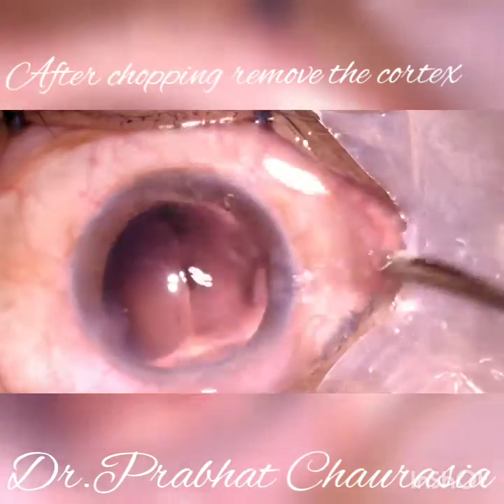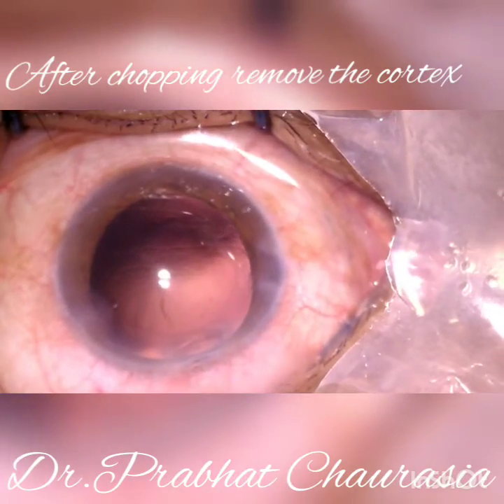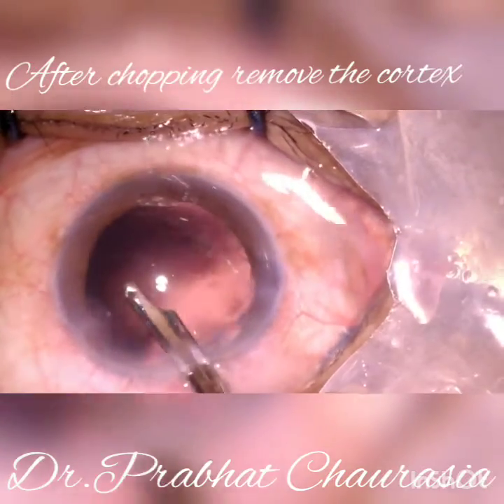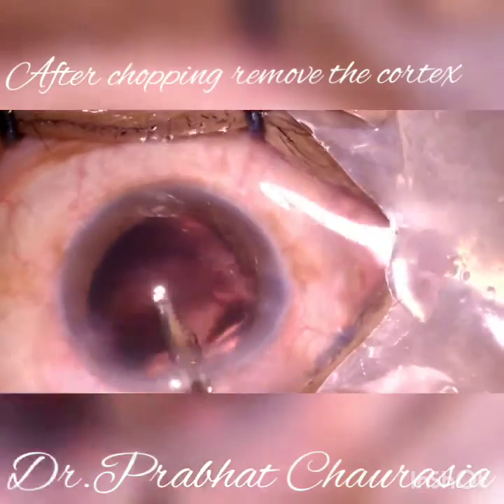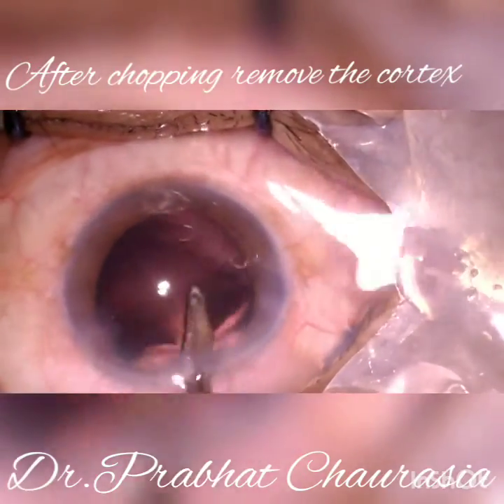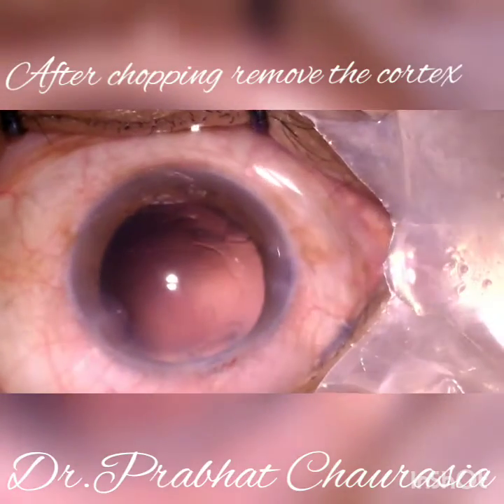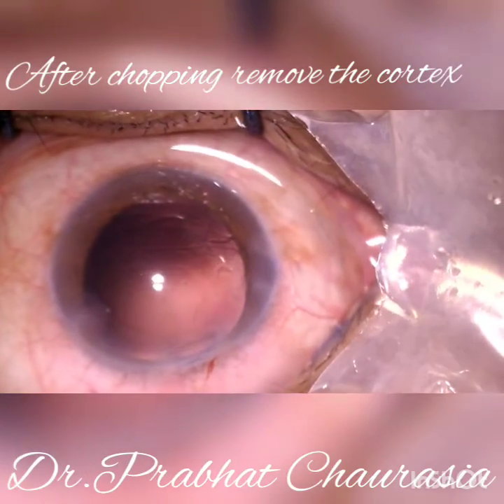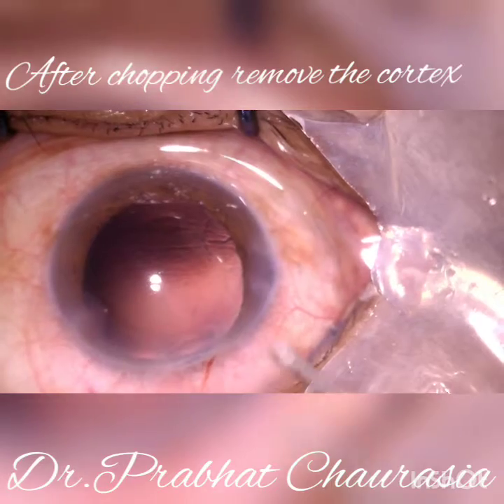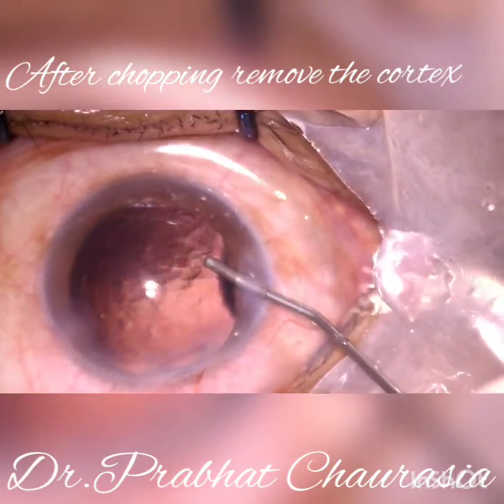This is hydropolishing. A jet of fluid is sufficient to remove the cortical fibers that are stuck to the lens capsule.